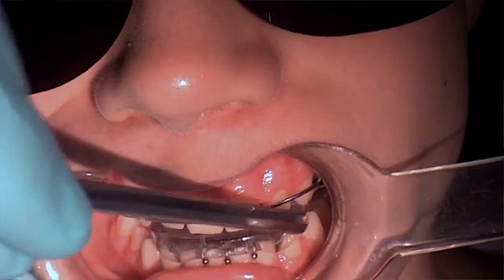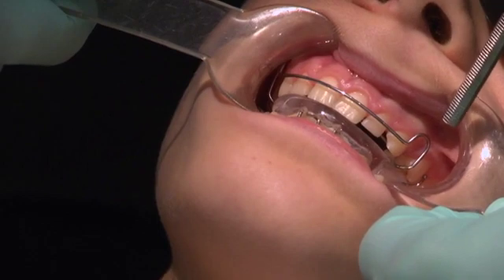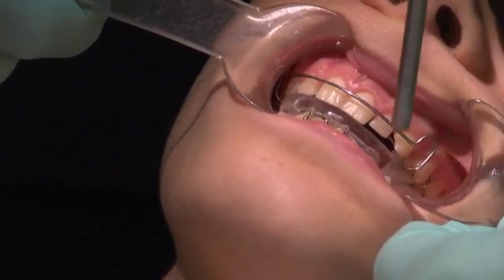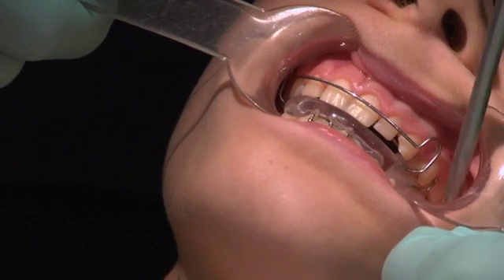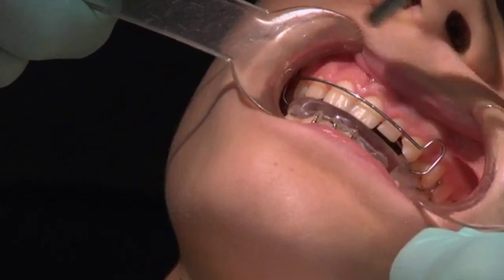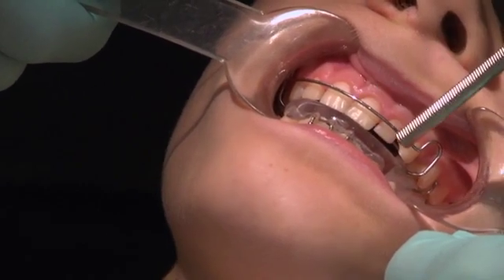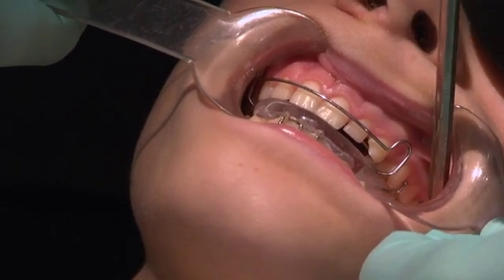The neutral bionator will have acrylic in both the upper and lower. This is the American style bionator; in Europe they use more the Balter style, where the labial bow bends back and around itself giving a vestibular shield, which prevents the cheek from rolling in when you're trying to erupt the teeth. The American style bionator-to-open will have incisal capping for the deep bite, labial bow, and a retention element.